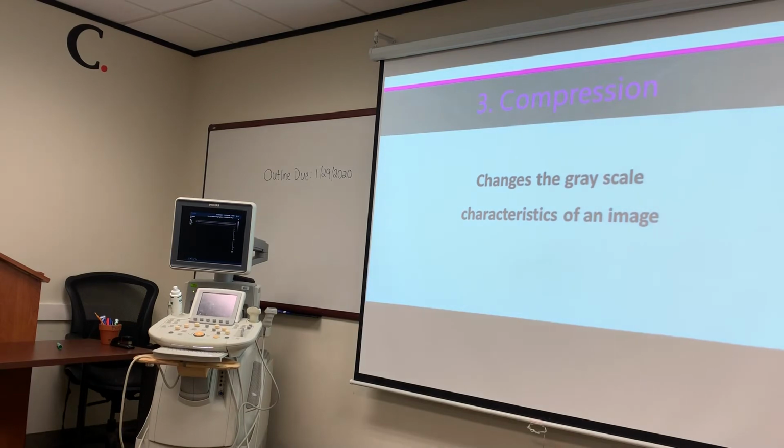Okay, let's do number 2. All right. So number 2 says I'm using the same 4 megahertz transducer and have adjusted the TGC perfectly, as represented by the red dotted line. Again, that's our baseline. You are now given a new transducer with an unknown frequency. The TGC is then adjusted to create the same image as that obtained using a 4 megahertz transducer. This new TGC setting is the green dotted line. Is the frequency of the new transducer greater than or less than the 4 megahertz transducer, and why, Pat?